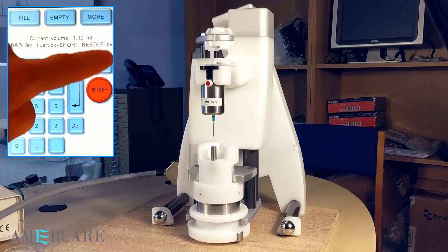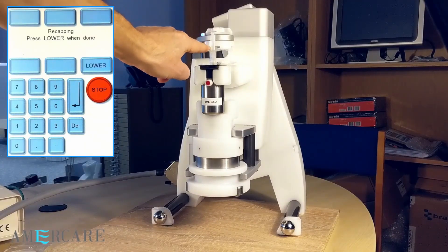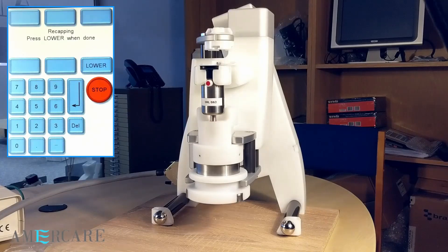Press recap. The carriage lifts automatically aligning the needle and the sheath. Simply apply light pressure to engage the sheath. Press lower to lower the carriage.